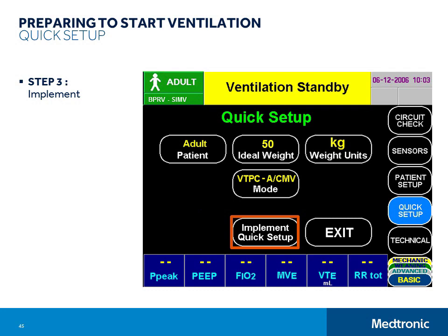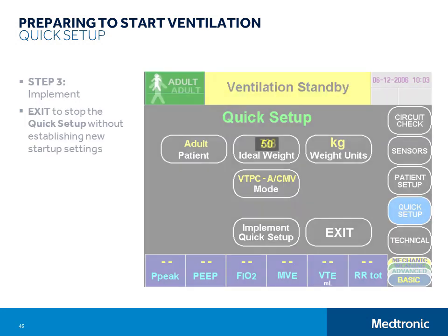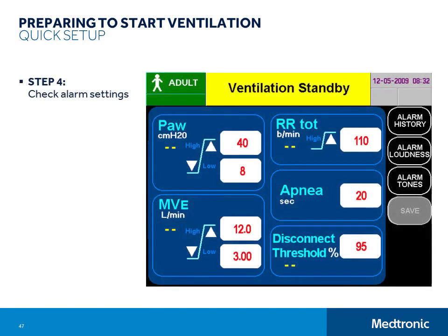If you touch the Exit button instead of the Implement Quick Setup, you will stop the Quick Setup without establishing new ventilator settings. You should check and, if necessary, readjust any ventilation or alarm settings that do not meet your clinical goals for the patient before connecting the ventilator to the patient. To check alarm settings, just press the Alarms button on the control panel. On the alarm screen, you will find all user-set alarm limits, the button for accessing alarm history, the alarm loudness setting, and the alarm tone selection setting. Remember that the ventilator remains in standby until Start Ventilating is touched.